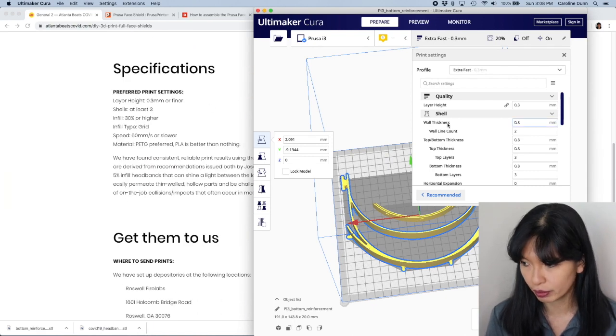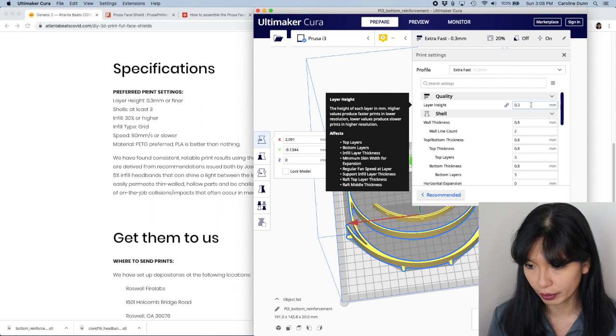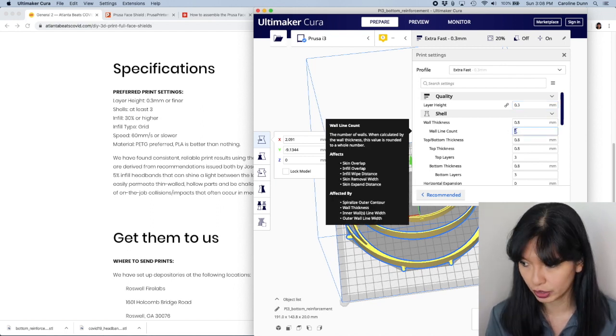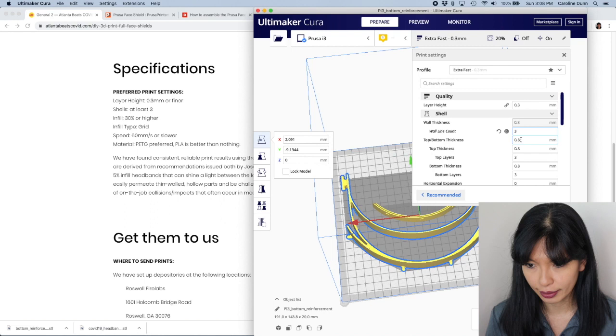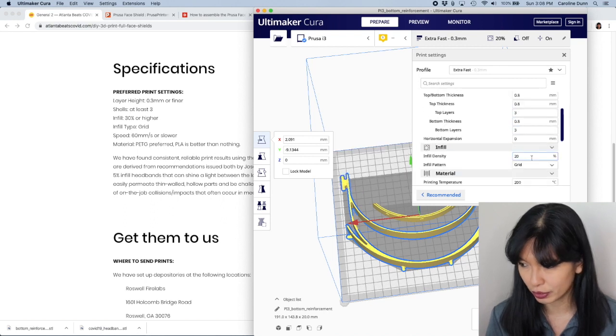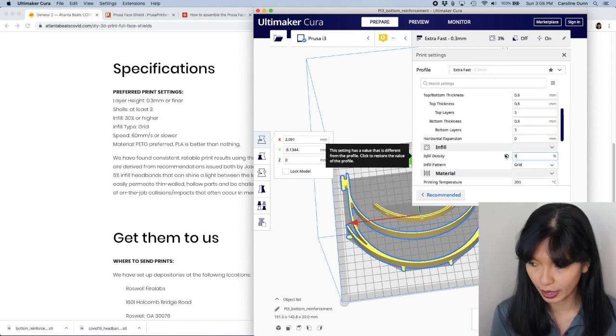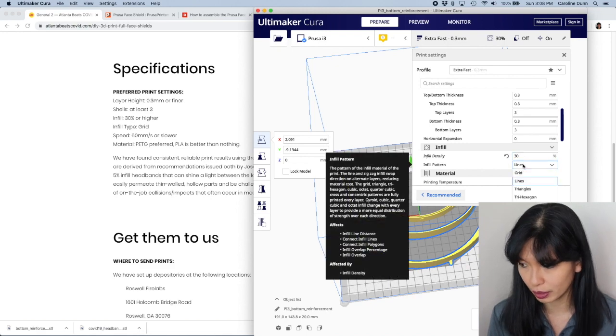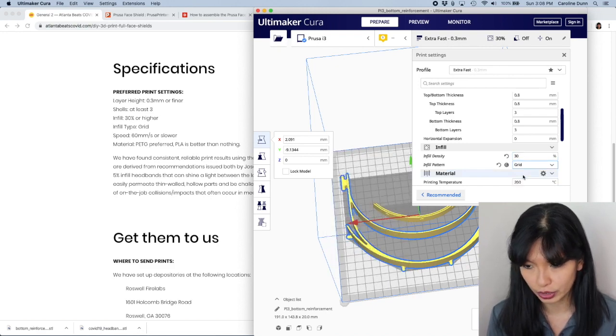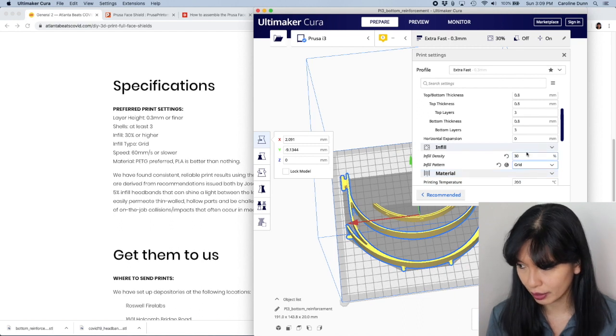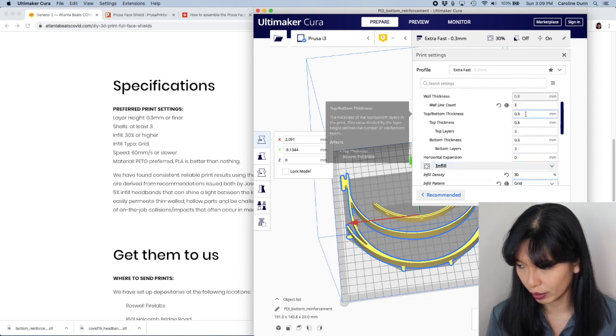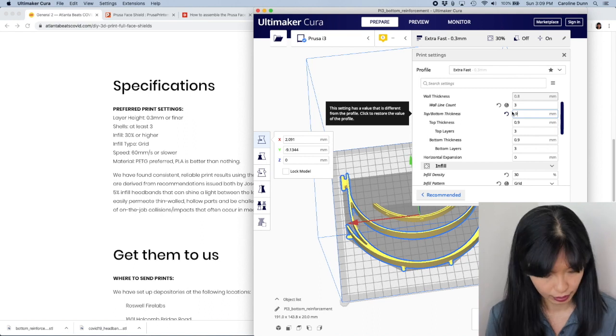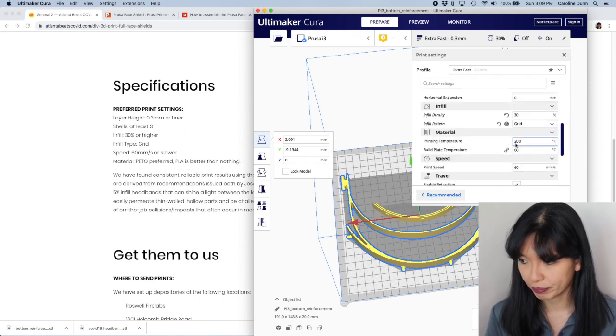And it says, all right, layer height, 0.3 millimeters or better. Shells, at least three. So I'm going to change two to three. And then it says infill 30% or higher. So I'll change that to 30%. It also wants the infill type to be grid. I will change that to grid. I think I saw somewhere on here that they want the thickness to be 0.9 millimeters as well.